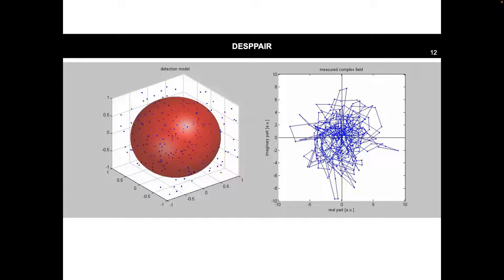So the vectors on the left, how are we measuring those? Is it from the origin of the thing on the left to every point? So what we need from this particular point is a field amplitude and a phase. So for the field amplitude, we say it's a point scatterer, so it's isotropic. That makes the amplitude part easy. Namely, it's the intensity of the incoming beam, or the E field of the incoming beam at this location. That is the amplitude that comes back.